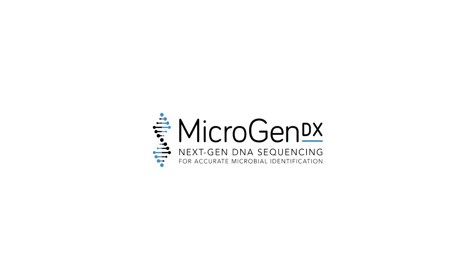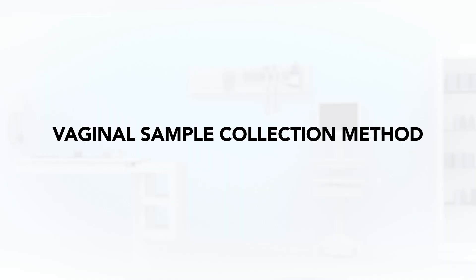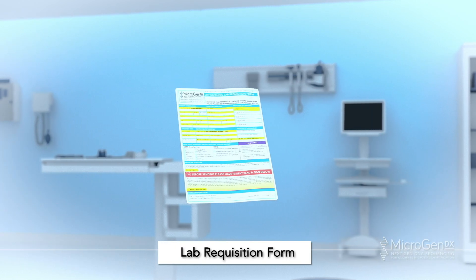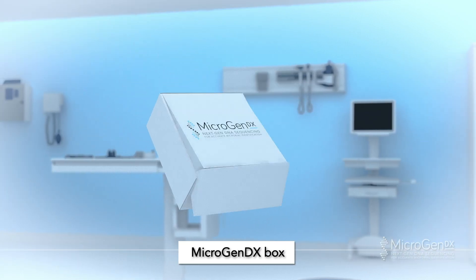MicrogenDX Collection Instructions: Vaginal Sample Collection Method. The MicrogenDX Collection Kit will include two vaginal swabs, a bio bag, a lab requisition form, and a MicrogenDX box.